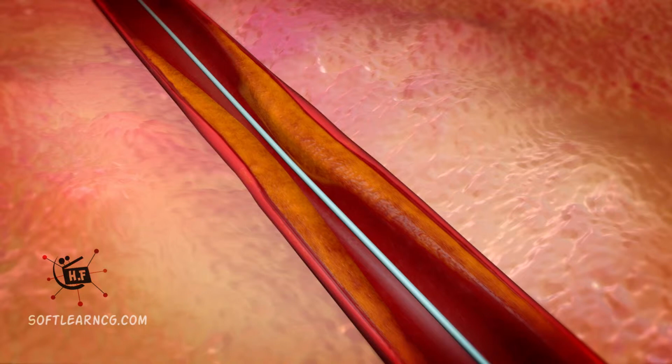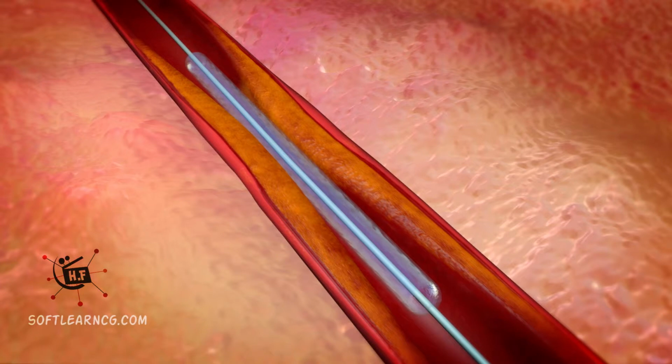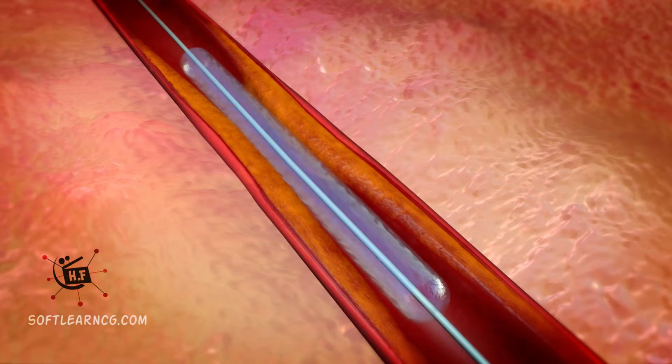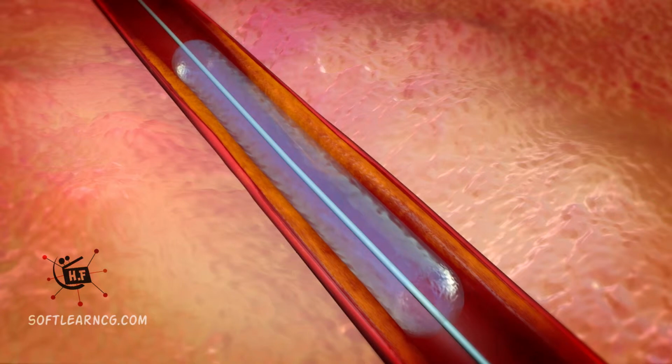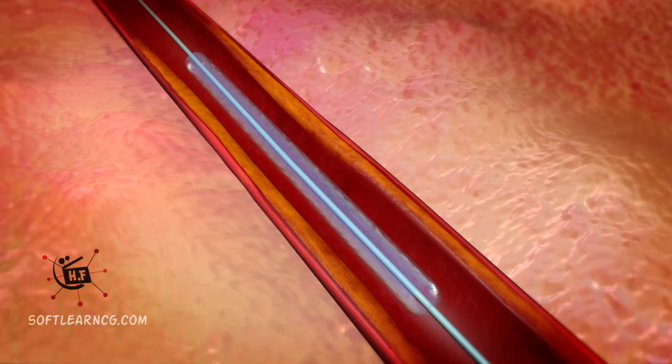On that wire, the doctor will pass a balloon-tipped catheter into the center of the narrowing. He will then inflate the balloon one or more times, compressing the plaque deposits against the wall of the artery and thereby improving blood flow.